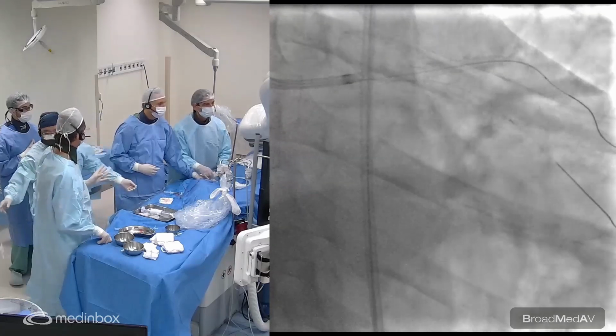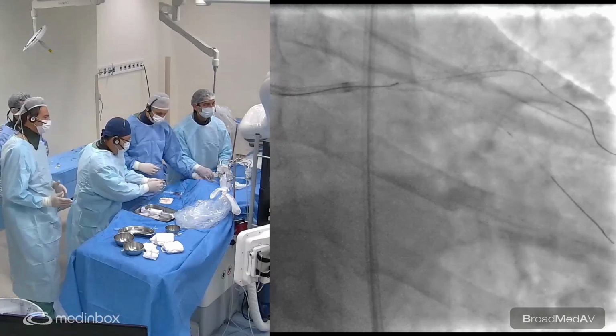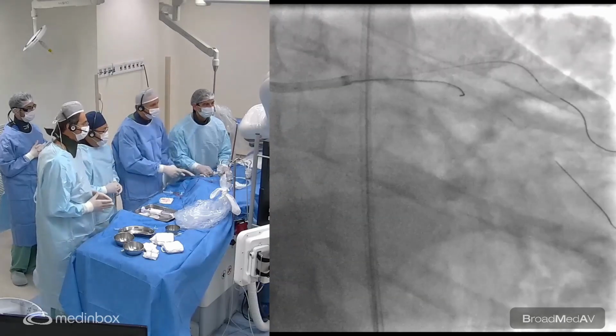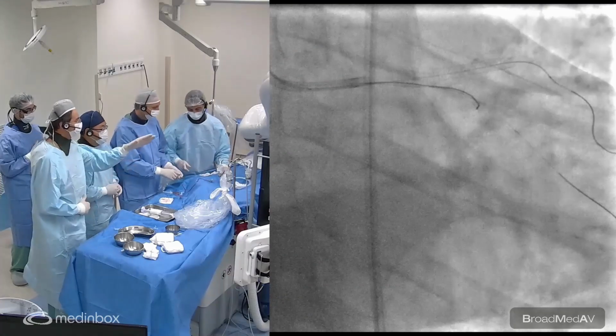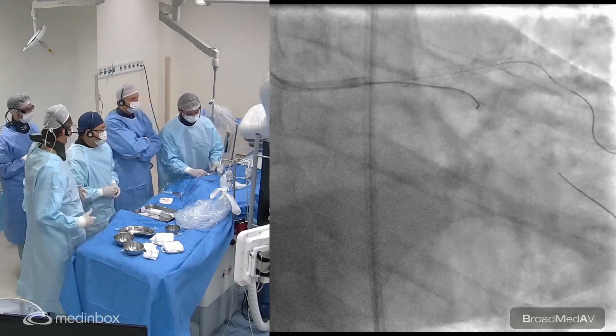Should we open the stent struts, or can you just leave it like this? Since we got some slow flow in the LAD, we need to cross. See how easy it crosses. Yeah, and this is a good part. That's what you're going to get, open cells towards the side branch. So should we need to do that, or can you leave it like it was?